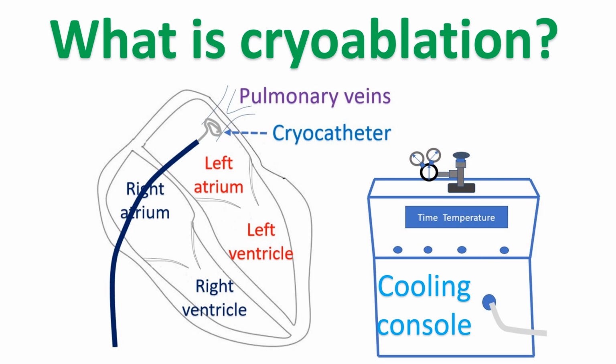Currently, the cryocatheter is much more expensive than the radiofrequency ablation system and is not as widely available. The advantage of the cryoprobe is the reversibility while treating abnormalities near critical heart structures.